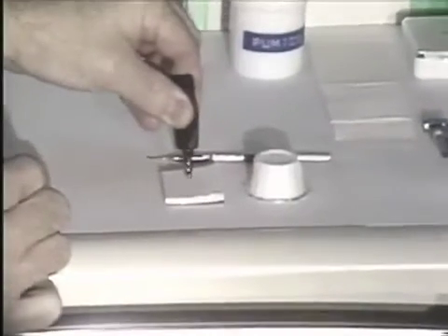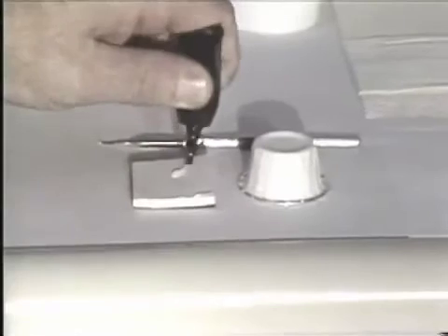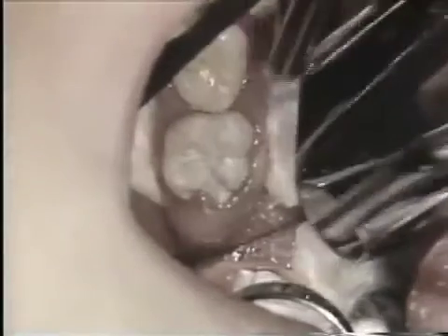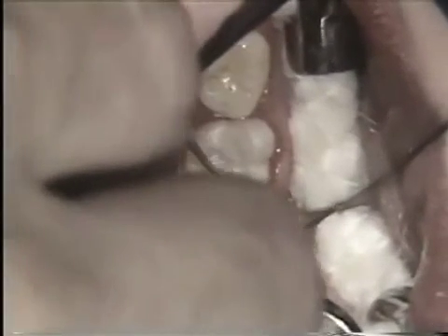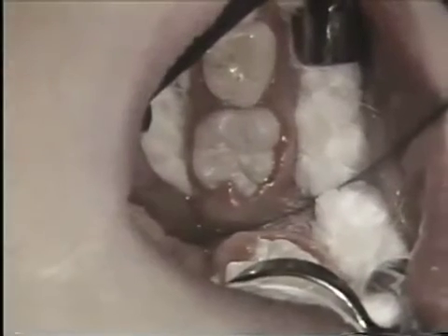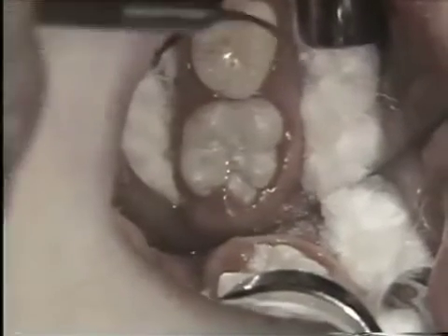In this case we're going to use Prisma Shield, which is a light-cure one-paste system. We place a good-sized drop of material from the tube onto a paper pad and reseal the tube to prevent pre-activation by light, then cover the pad with an opaque dappen dish. Using a small ball burnisher or dicall applicator, we place the first initial increment on the distal aspect of the surface, flowing it through the distal pit and the distal buccal and distal lingual grooves. A second increment is placed on top and nursed through the grooves to eliminate air voids into the central pit area.